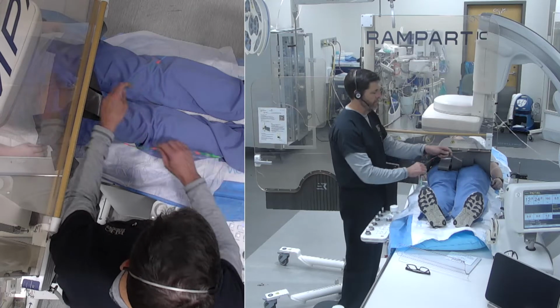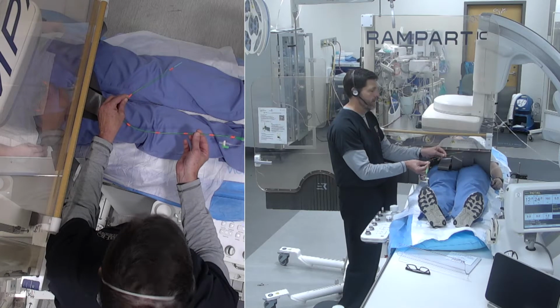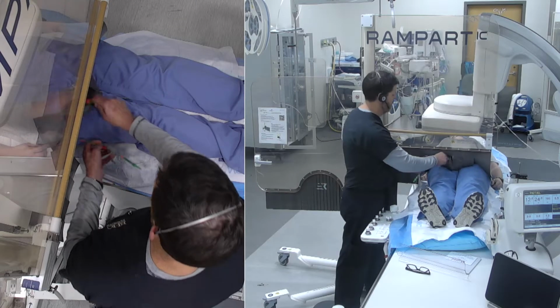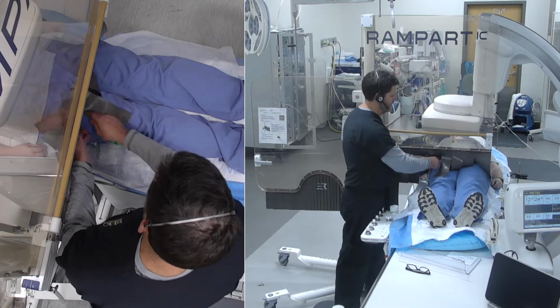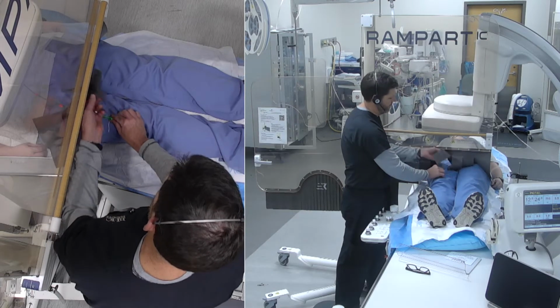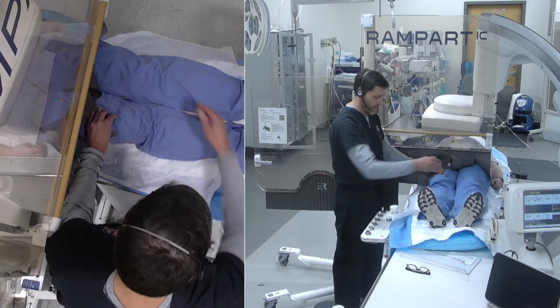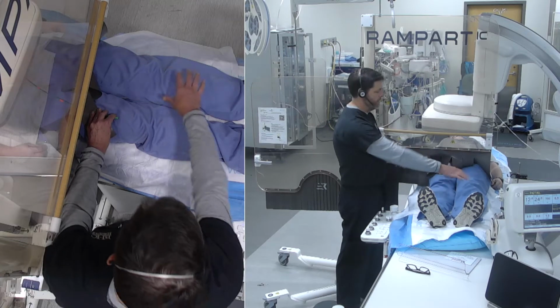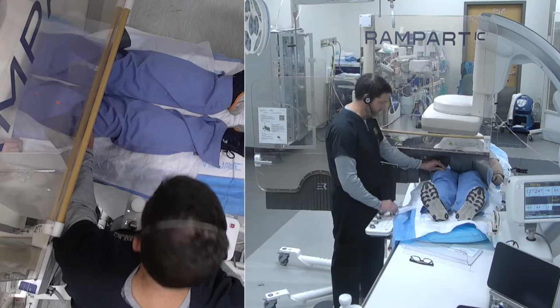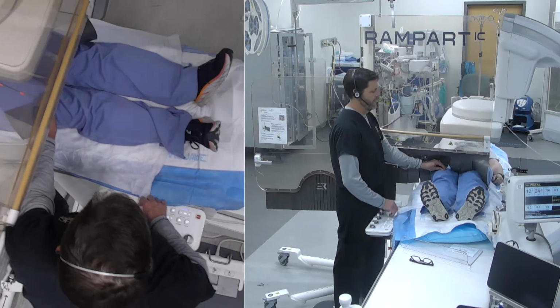The reason I use a slightly longer sheath is because when you're going up and over, you're going to want some of your catheter still extending out and below your soft shielding. So on this patient, if we're going up and over, typically I'll have about this much of my sheath sticking out. And so that still gives me access to go up and over, and then image that leg. Again, I can just advance it in, open the shield if I need to, and I can move my camera down and go all the way down the leg.